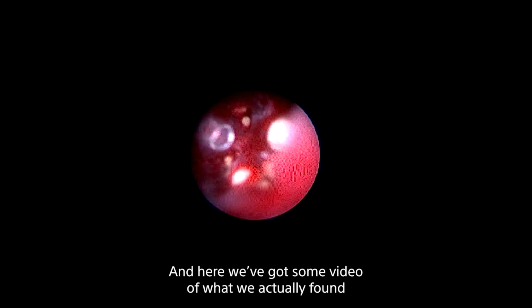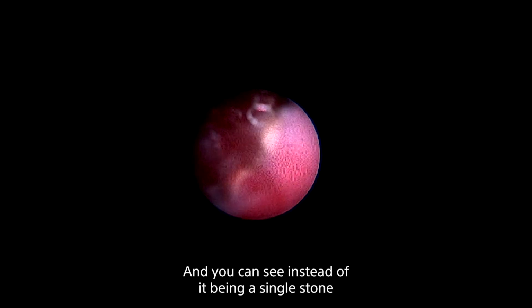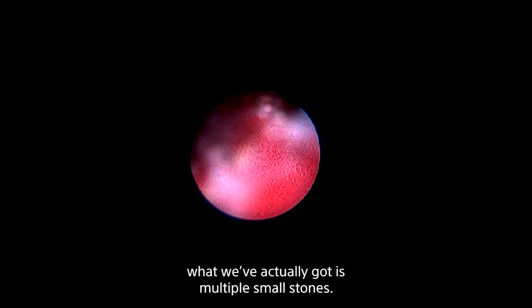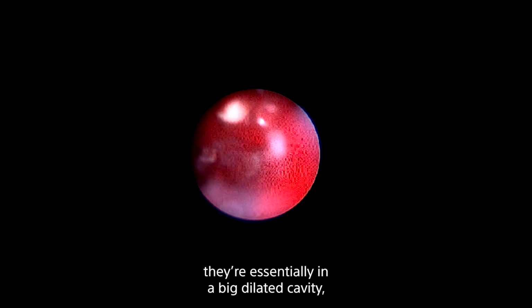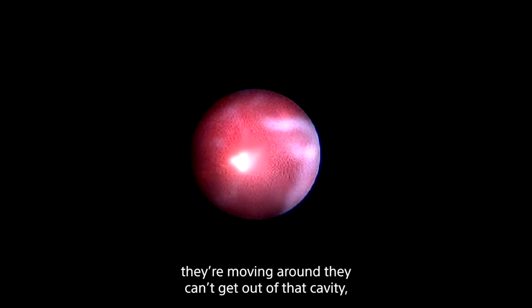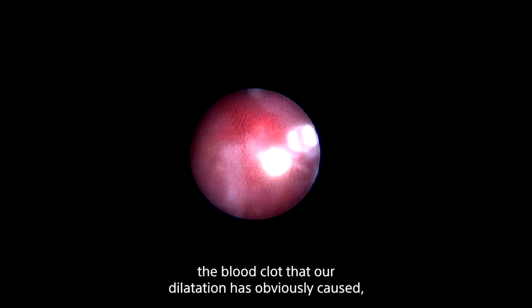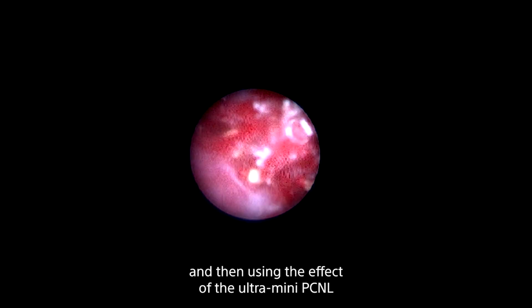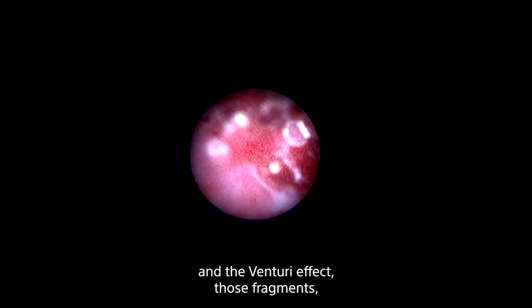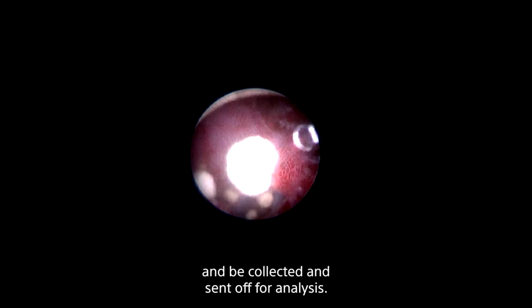And here we've got some video of what we actually find when we're inside this diverticulum. And you can see that instead of it being a single stone, what we've actually got is multiple small stones. And these are tiny stones which have accumulated because they're essentially in a big dilated cavity. They're moving around. They can't get out of that cavity because of the very narrow neck. And what we're able to do is just free them up from the blood clot that our dilatation has obviously caused. And then using the effect of the ultra mini PCNL and the Venturi effect, those fragments, those tiny little stones will then follow us out and be collected and sent off for analysis.